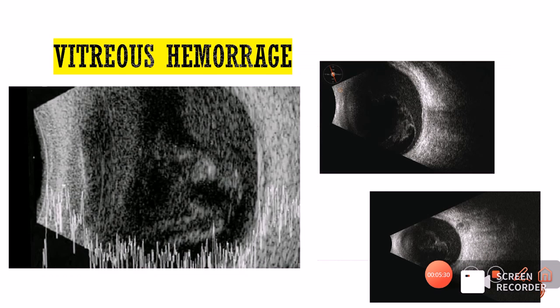Now as time passes and the vitreous hemorrhage starts resolving, these vitreous dot echoes, which had very low reflectivity of about 5 to 10%, will clump together, and these dots will become denser and the reflectivity will also increase. As can be seen over here, all the cells have clumped together. So this is clumped vitreous hemorrhage, organized into membranes also.